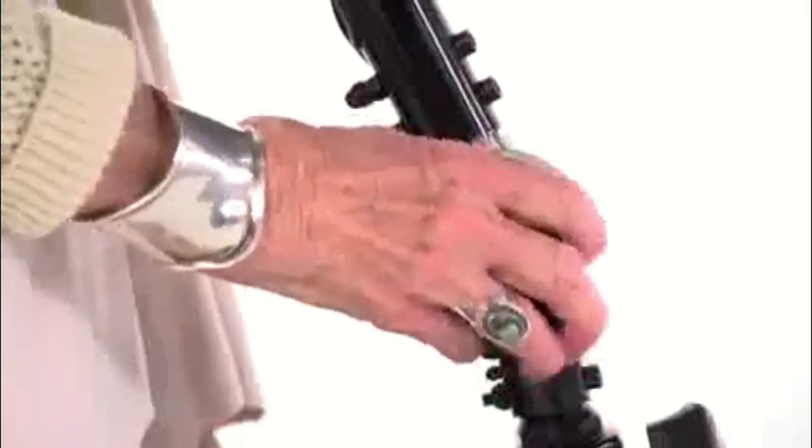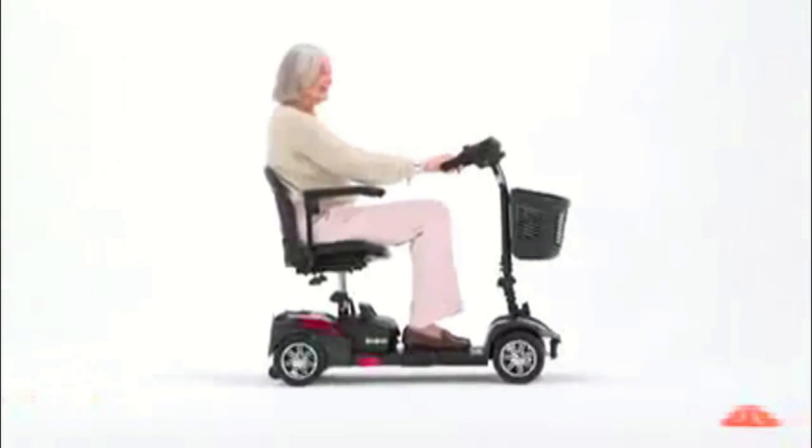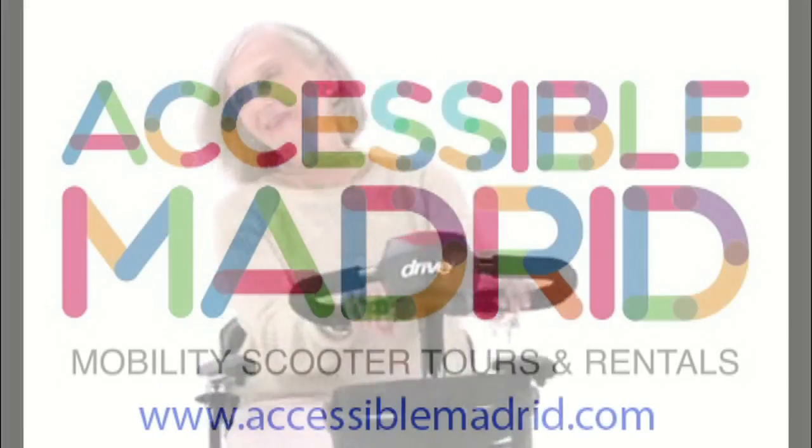Plus, the tiller's angle is adjustable to position the controls in the most comfortable driving position. You can always count on Drive Medical to bring you convenient and innovative lifestyle solutions. Now, and for the road ahead.